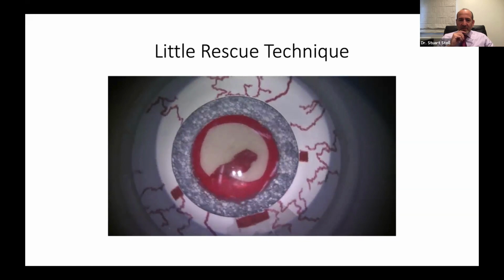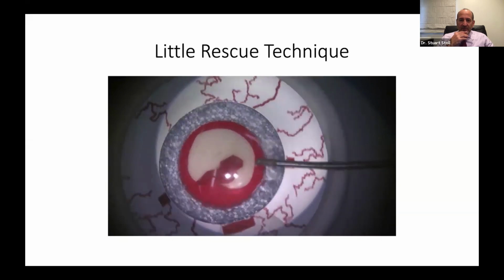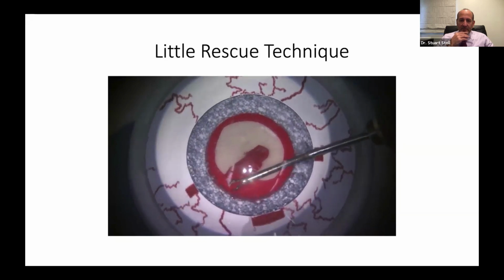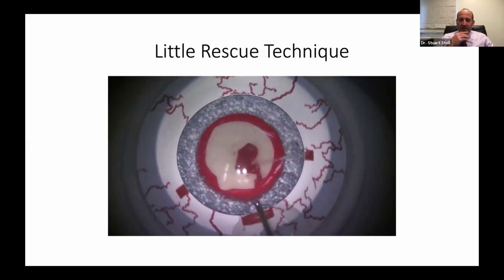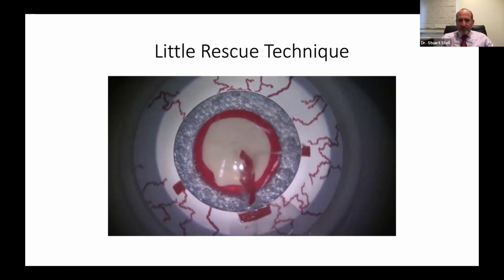Reposition the capsule. This would be a great time to reinflate with viscoelastic, deepen the chamber, flatten the curve, and we're going to come in from a different approach angle. And now once we grasp, it's almost like an immediate rescue maneuver. It's that immediate radial tear, bam, saves it and continues on. Fantastic save, and then optimize your approach for the final finish there. And there you go.